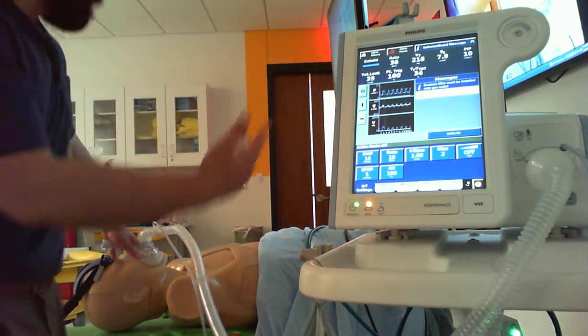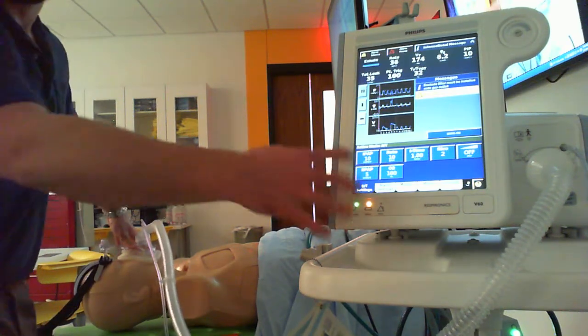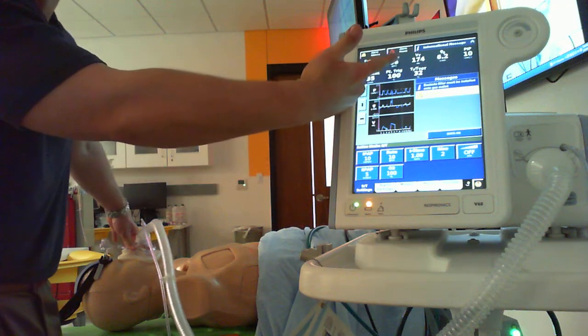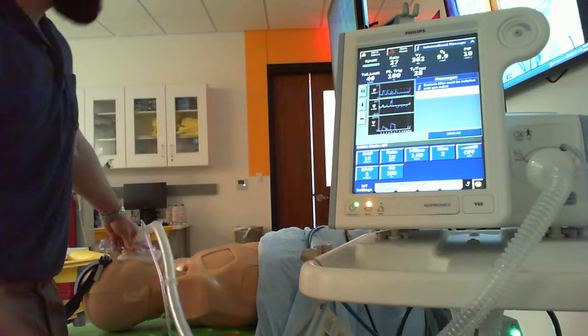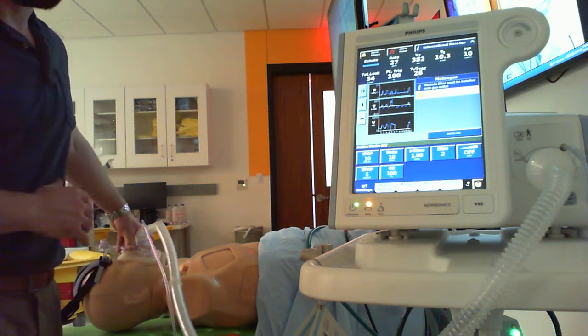So I do look at leak, but I'm also looking at my patient's face. All right, you feeling okay? I'm kind of letting them get used to this. Clinically, I'd be making changes to their settings because this guy's breathing 36 times a minute and very suboptimal tidal volumes. All right, I am going to get him strapped in for the sake of this video, and then we'll talk about making some changes here.